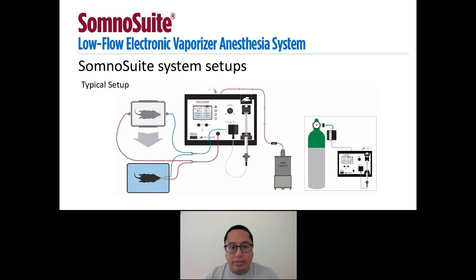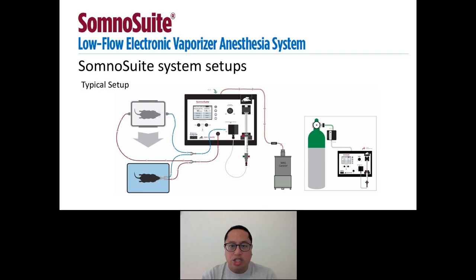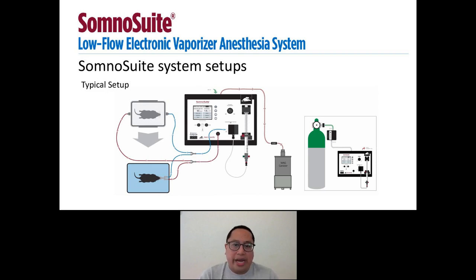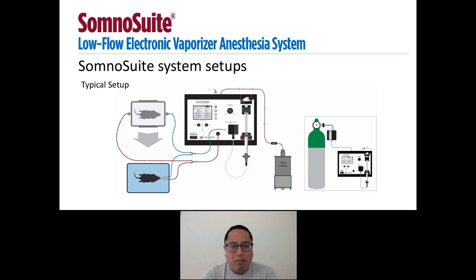Now I will take you through some various SomnoSuite system setups. The diagram displays a typical setup with an induction chamber and a face mask using a two accessory adapter. The anesthesia outlet marked in blue is our inspiratory line. The line comes from the vaporizer block and splits into two branches, each leading to either the induction chamber or the face mask. Leading out from the induction chamber and the mask is the expiratory line marked in red, which passively carries waste gases to the WAG canister.